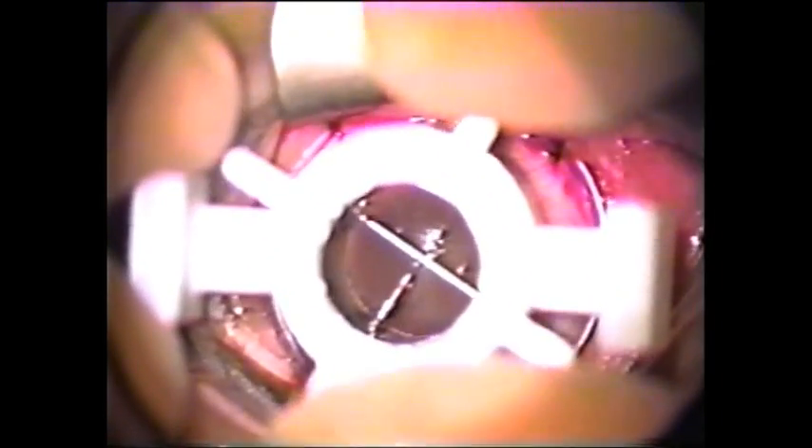Lift the trephine lightly to test if the suction is holding adequately. Hold the trephine lightly, allowing the cornea to return to its normal curvature, then begin rotating the trephine blade. As the blade rotates, it travels 0.0635 millimeters downward per one-quarter turn (one spoke), and 0.254 millimeters downward per complete revolution (four spokes), gradually penetrating the cornea.